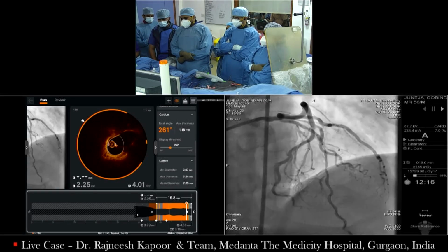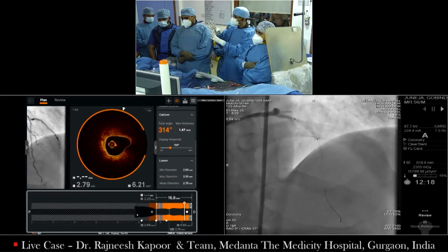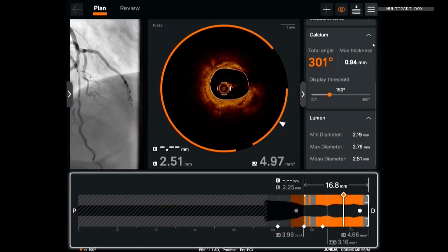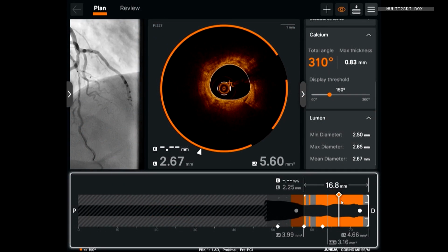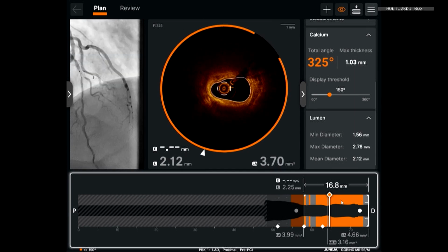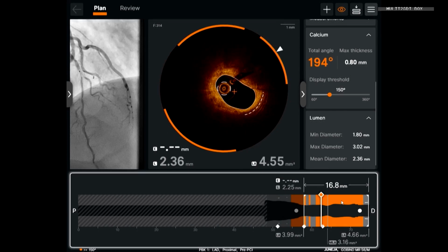Yeah, we can see it on a small screen. Okay, make it bigger. No, it's okay. Yeah.